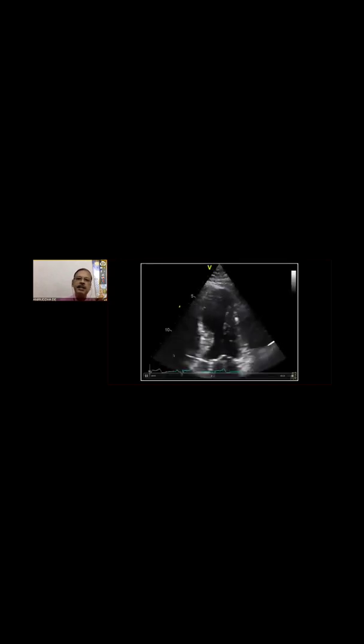Now I'll show you how the parametric image, the bullseye, gives you a very important idea in echocardiography. It's a thinned out and dyskinetic LV apex. You can see very easily from the 2D the thinned out and dyskinetic LV apex, absolutely dyskinetic.